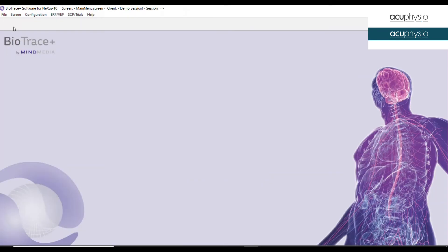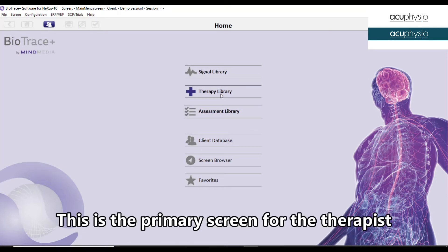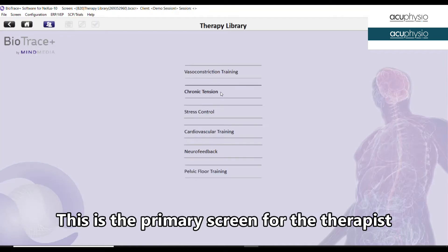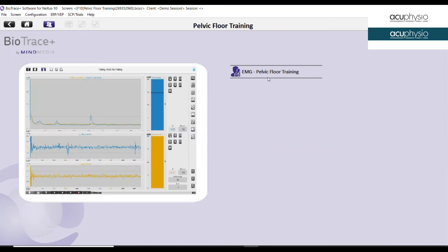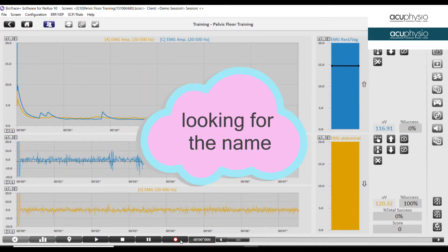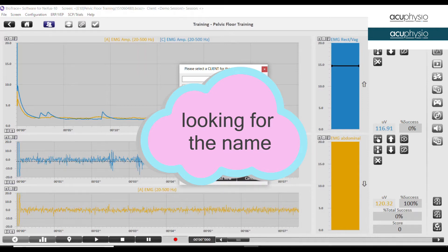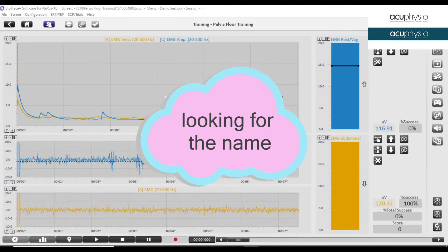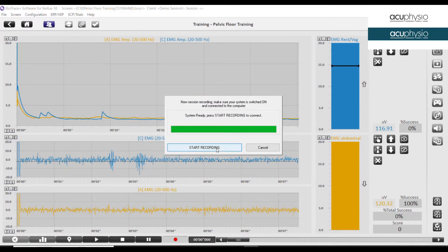The biofeedback system that we are using is called Biotrace. In this system, we need to activate the program first, then find the patient's name and input their data. After that, we can start doing the training. Before we start, we have to make sure the machine is working, so we're going to ask the patient to do a few sessions of contraction and see if there is any signal occurring. If there's an improper connection, you are not going to be able to see the signal.